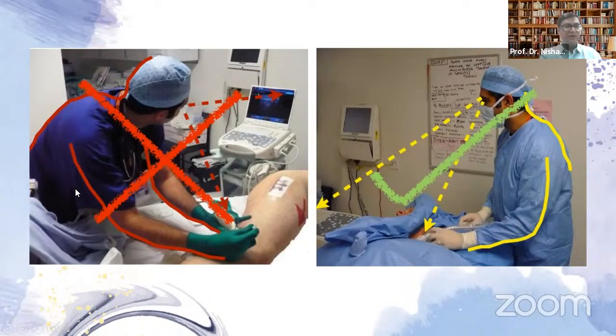So what is happening is ultimately he'll have a backache. He'll have to look first at the monitor, then at what his hands are doing, and ultimately end up with neck pain, back pain, and arm pain. Plus, he'll take a lot of time, the image won't be good, and the patient will also not be comfortable.